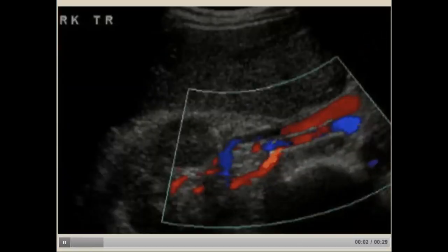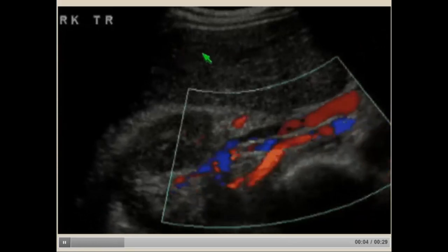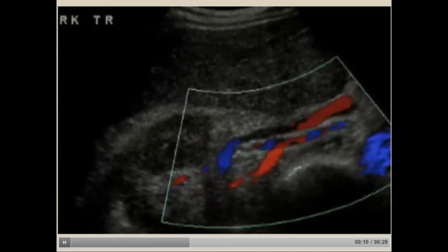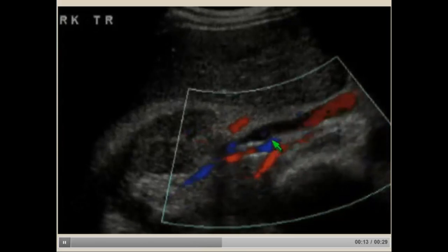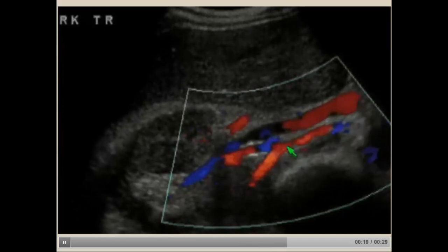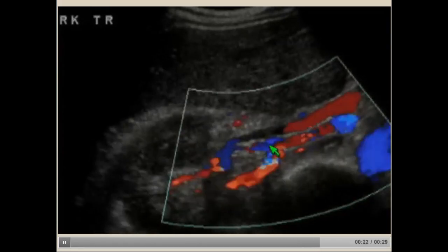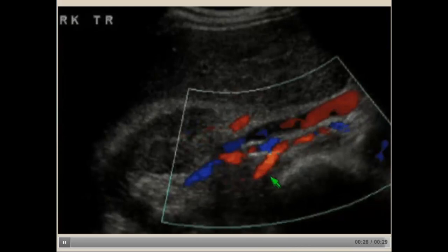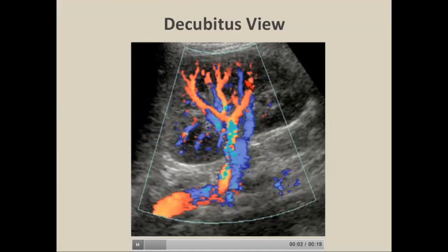Here's a look at the right renal artery through the liver. I've adjusted the pulse repetition frequency and gain so we can see the artery very clearly. You can see there's no evidence of aliasing and no elevated peak systolic velocities to suggest underlying stenosis — you can follow it all the way in. You can even appreciate early branching of the renal arteries before the hilum with no evidence of stenosis.